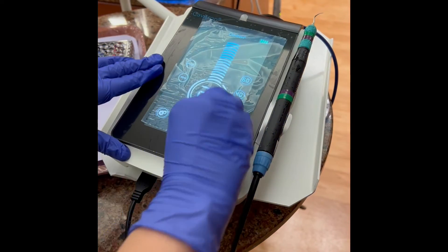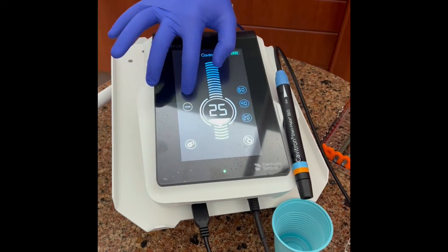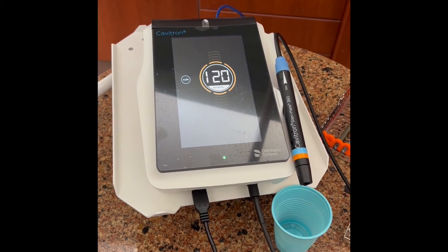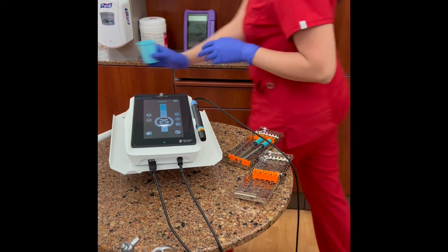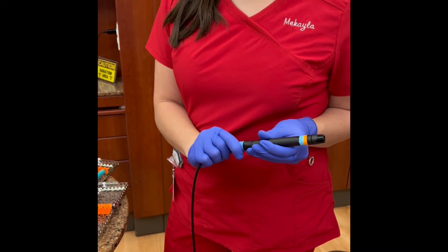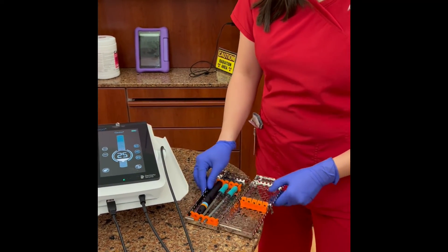Remove the blue barrier. Remove the insert. Purge the lines. Remove the SteriMate and place into a cassette or pouch with the Cavitron inserts to prepare for sterilization.